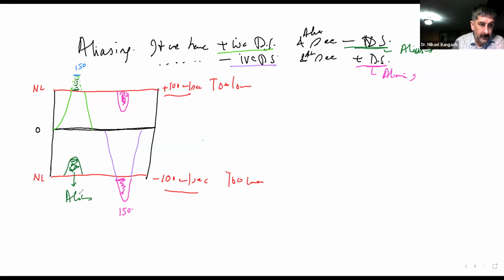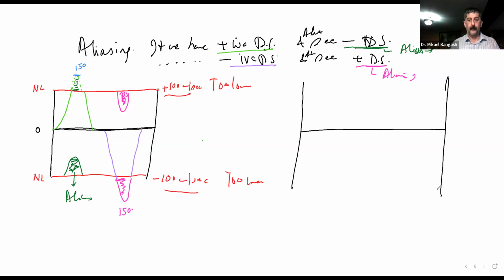let's just do it this way. Aliasing, no aliasing, that's not going to be the matter here. Let's say we have a positive Doppler shift, and there's no aliasing. We may have a negative Doppler shift, and let's say we're aliasing free here.